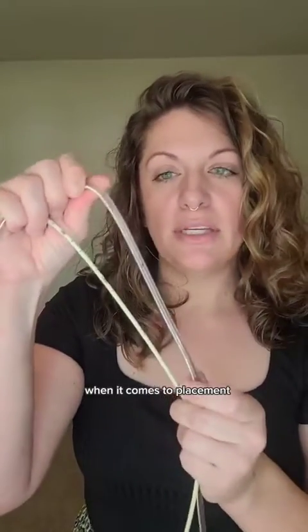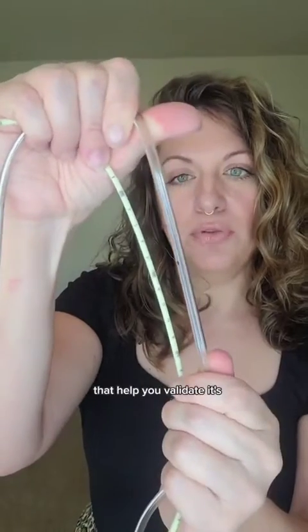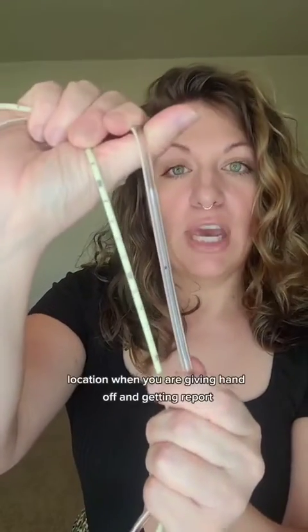Sometimes they will want these inserted post-pyloric or in the first portion of the duodenum, depending on what's going on with the patient. The gold standard for both of these tubes when it comes to placement is going to be an abdominal x-ray — a KUB, a chest-abdomen, whatever your facility actually calls it. There are also markings on these tubes that help you validate location when you are giving handoff and getting report.